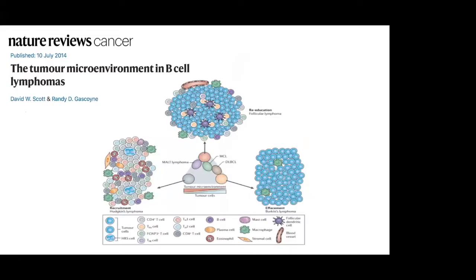Before we proceed to the diagnostics and the treatment response assessments with whole body diffusion, I just wanted to highlight this paper on the tumor environment of the B-cell lymphomas. When we look at lymphomas on CT, they look very bland, we measure them, and that's about it. But actually, it's an extremely heterogeneous group of tumors with completely different microcellular structure, different prognosis, and different treatment responses.